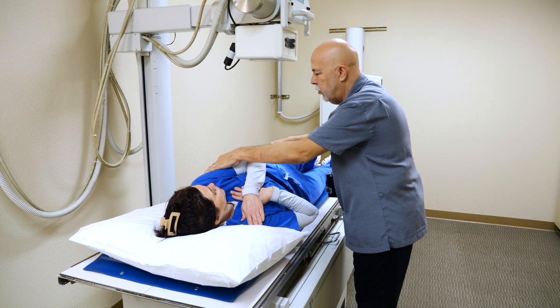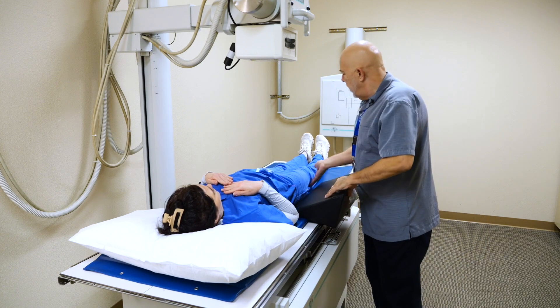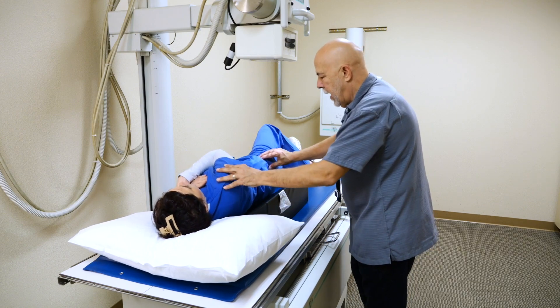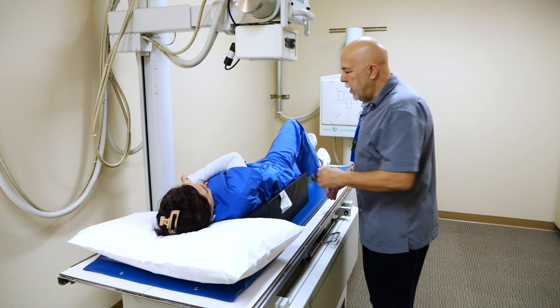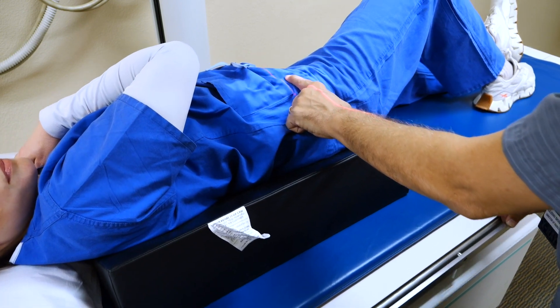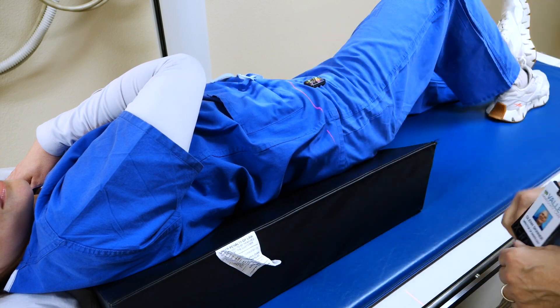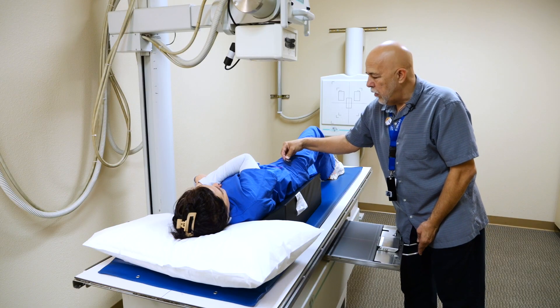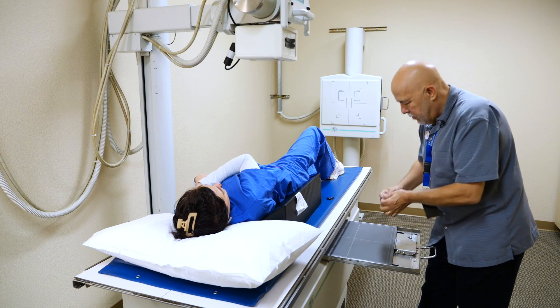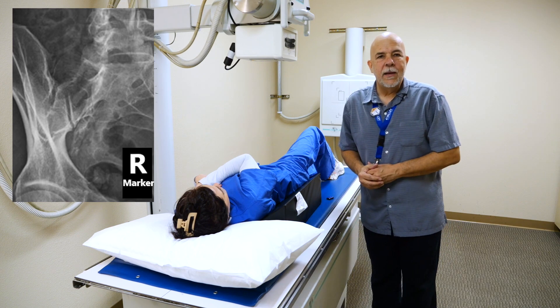Have your patient roll towards you like a log again, roll back flat. If you do that, your patient is still going to be centered to the table really well. Bring this knee up, right hand on the left shoulder and roll away, and roll back. The only adjustment we need to make is recenter for the ASIS — centering one inch medial to the ASIS. Then change your marker. Some people will put the marker on the patient so you know where you are in the light field; I prefer to use the other marker and place it on the IR and expose the image. That is our right SI joint.